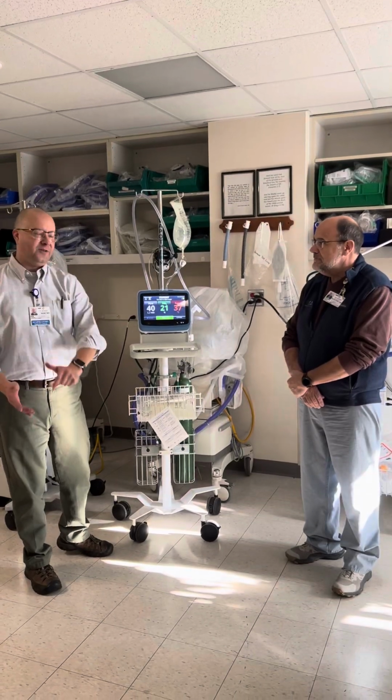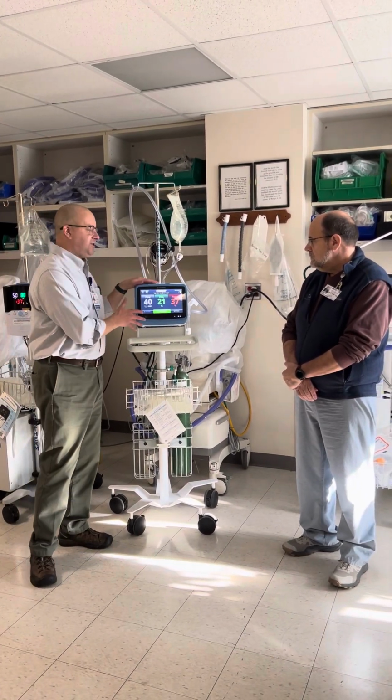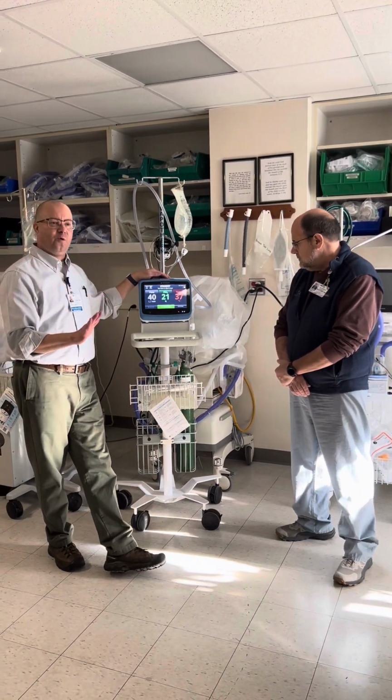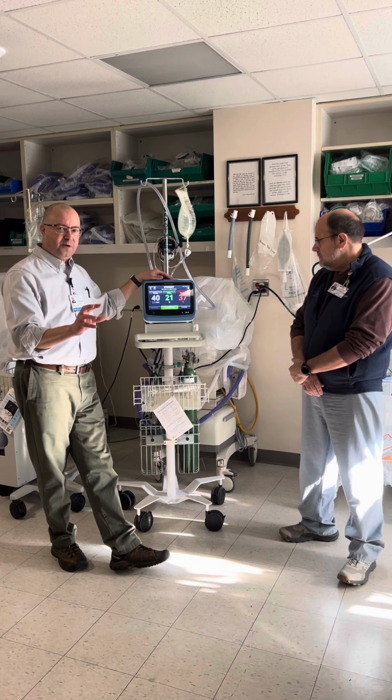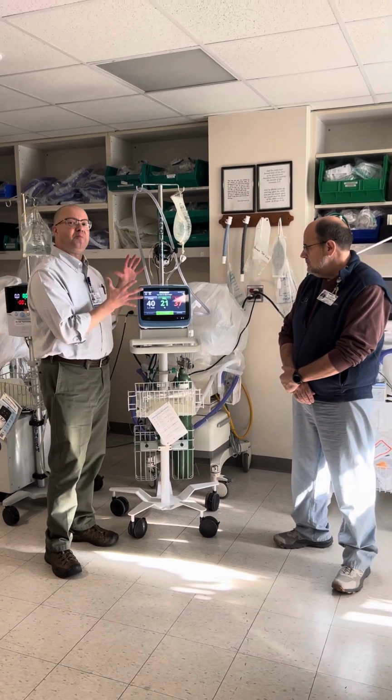So here we're back with you. Now we're going to move from the Precision Flow over to the HVT 2.0. Same idea, everything we talked about before, treating hypoxemic respiratory failure, treating hypercarbic respiratory failure. It's just a nicer platform.